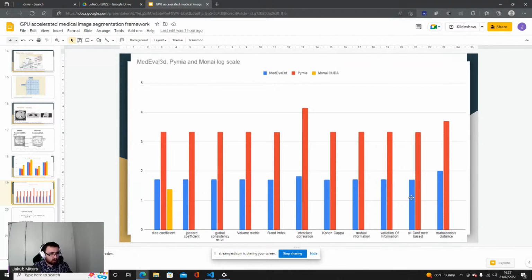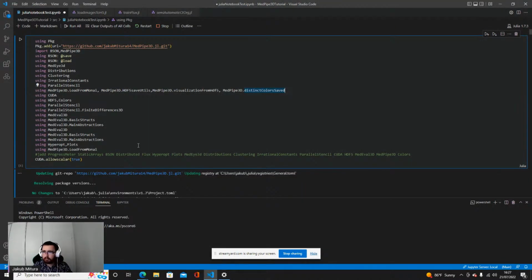Basically, this is not yet completely published, but you will also see it today. The metrics in Julia, when implemented by CUDA.jl, are order of magnitude faster than the best implemented CPU, and similar to the state-of-the-art GPU on the Monai.